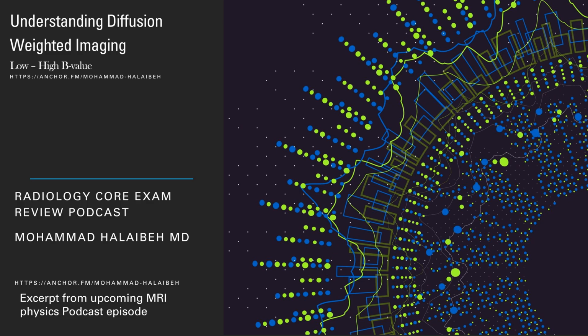Again, let me explain that again. We said the b-value determines the amount of signal loss due to random motion. If we have a very high b-value, we are going to ignore a lot of signal because of self-diffusion, and that's the threshold. That's why we get low b-value and high b-value, and the final image is based on the comparison of those two results. But the higher the b-value determines the amount of signal loss. So higher b-value leads to higher loss of signal.